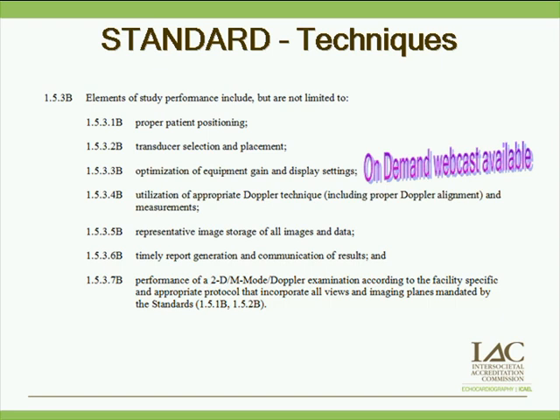You don't always optimize your settings correctly. And I can tell you we've seen many times studies submitted to us for review where the sonographer has started the study and ended the study and has never optimized the gain, never changed any of the settings, just basically scanned. And that's not displaying your best work. You need to always remember to optimize those equipment settings.